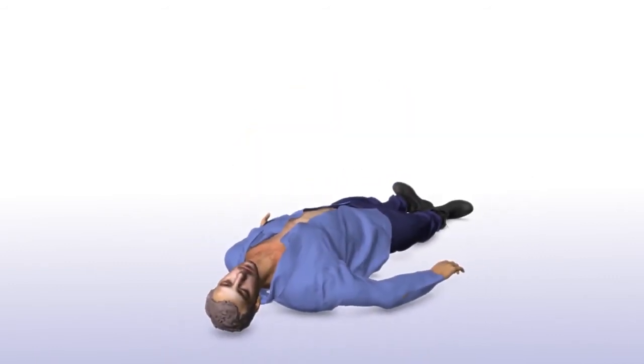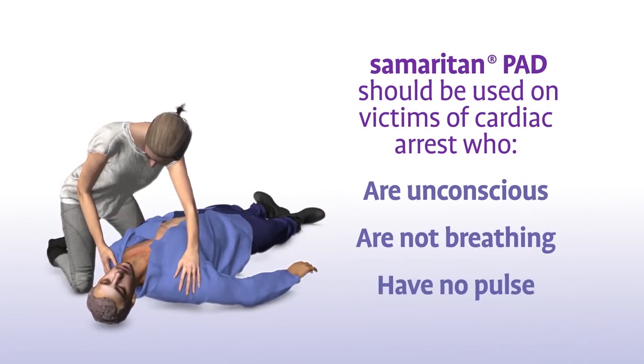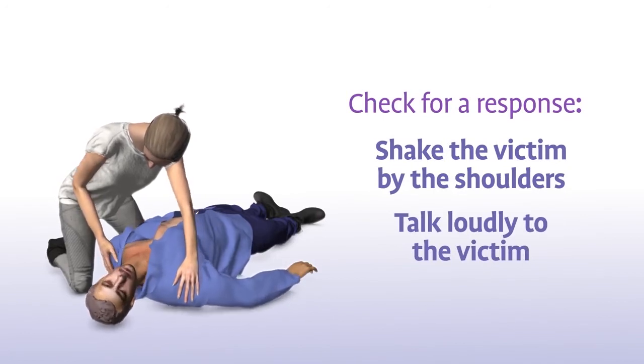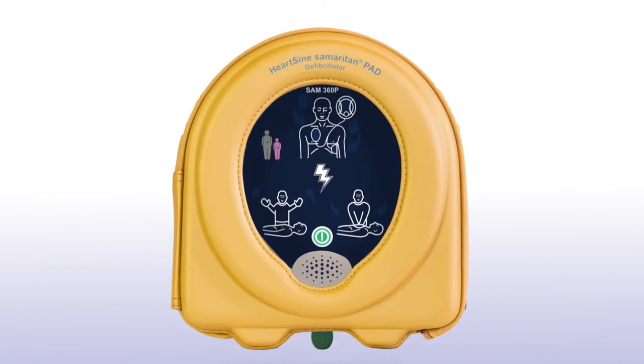The Samaritan PAD should be used on victims of sudden cardiac arrest who are unconscious, not breathing and have no pulse. Check for a response by shaking the victim by the shoulders and talking loudly to the victim. If the patient is unresponsive, immediately call for medical assistance and get the Samaritan PAD as quickly as possible.